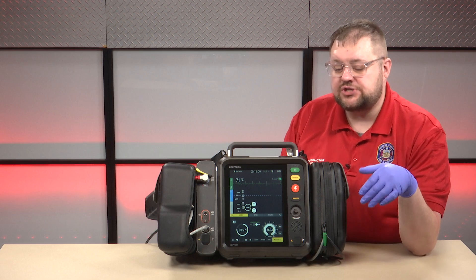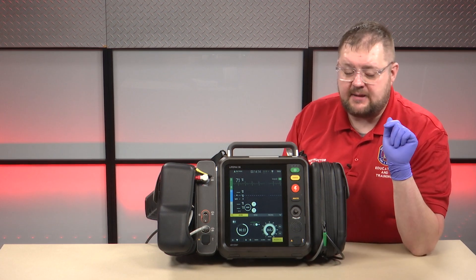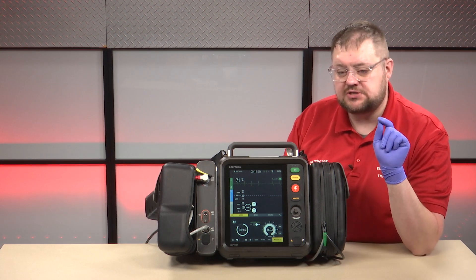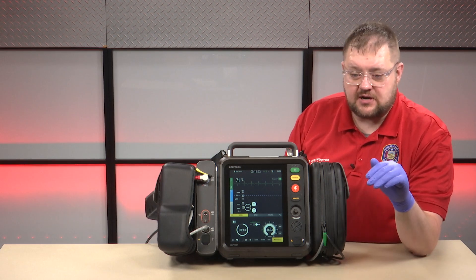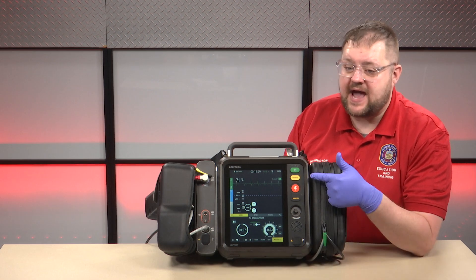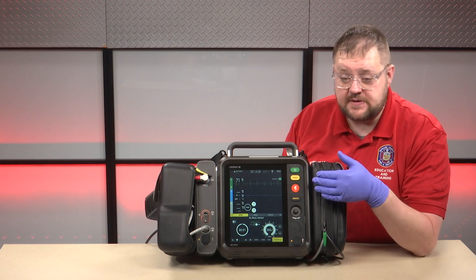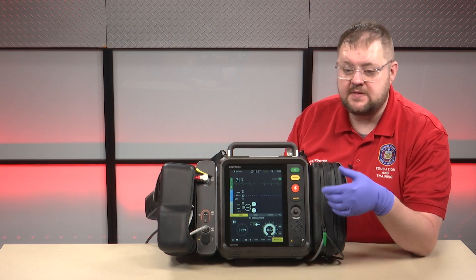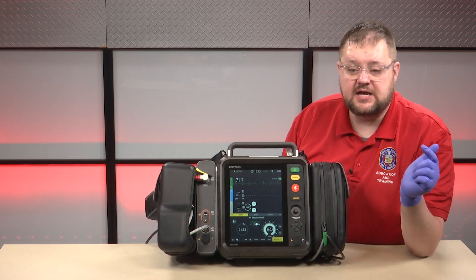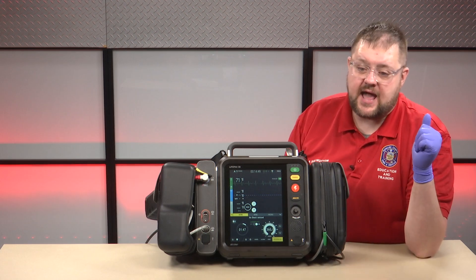It will not shock, though, until the clinician actually presses that button. This alleviates the issue where, in our current practice, someone presses the charge button 15 seconds prior to the end of the two-minute cycle — now it automatically charges if it sees a shockable rhythm. That being said, it is important for the ALS clinician to confirm on the screen, using their clinical knowledge, that it is indeed a shockable rhythm. That's why there is a safety mechanism: it will pre-charge for you, but it will not actually shock.